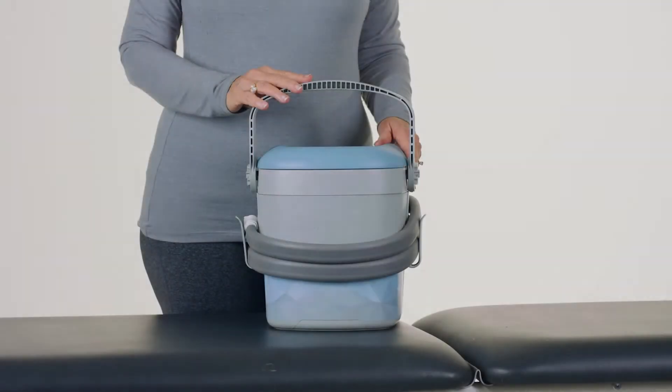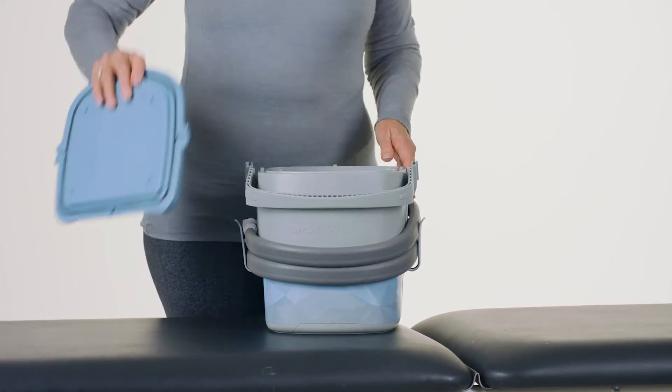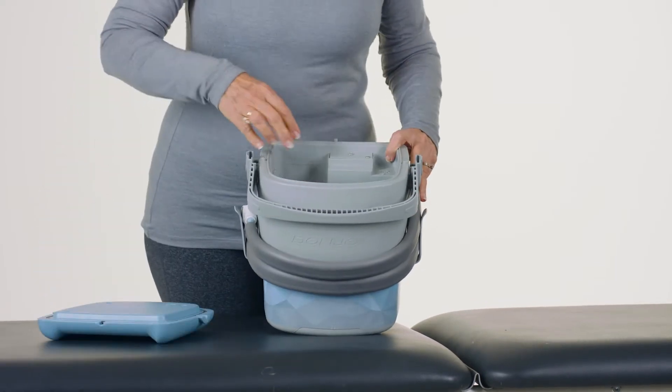Prior to applying the cold unit pad and/or the hip brace, prepare the Iceman Classic Cube. To unlock the Iceman Classic Cube lid, press the handle forward. Add ice to the fill line inside of the device and then add cold water to the fill line.